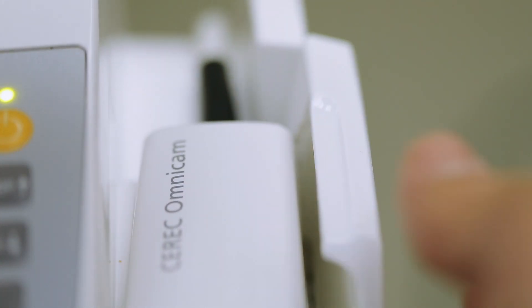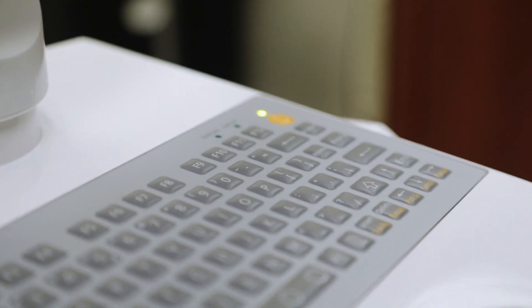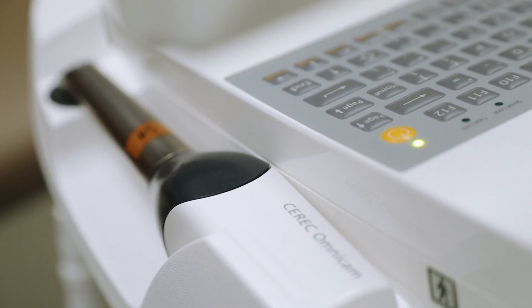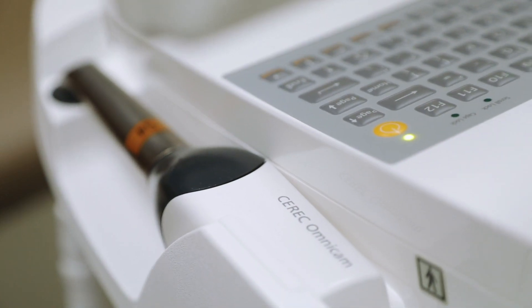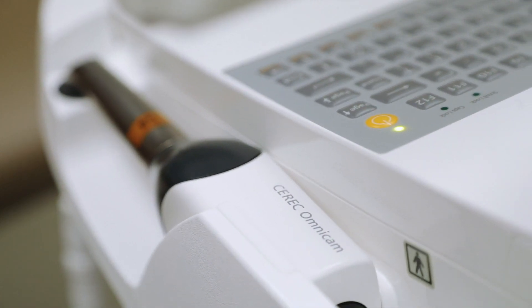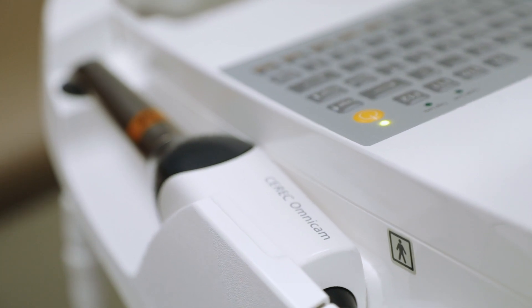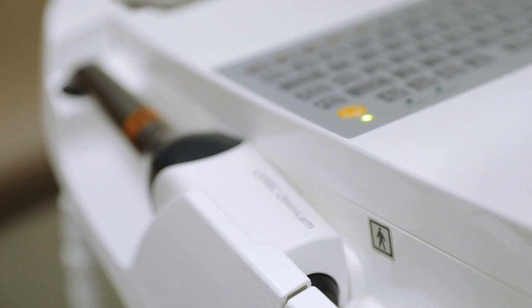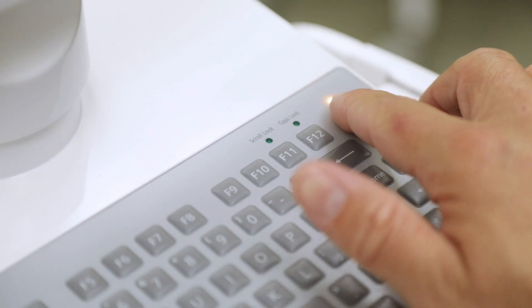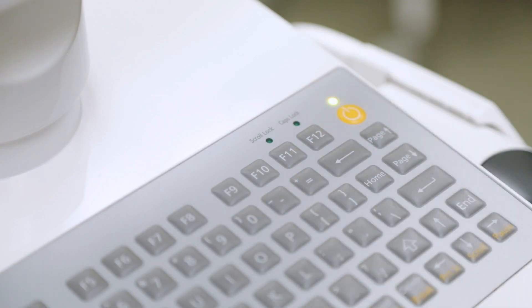So let's go ahead and put the camera back down on the keyboard. At the top right of the keyboard you will see the power button for the machine. If this is not on, go ahead and turn your machine on at this time. Once the machine is on, if you have not opened the CEREC software, you will do that now.